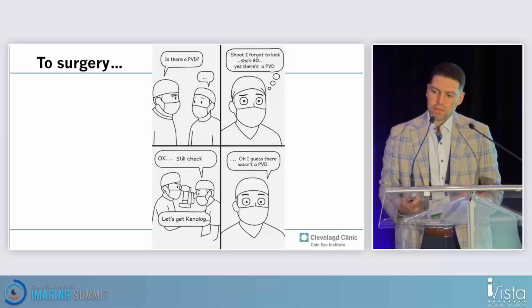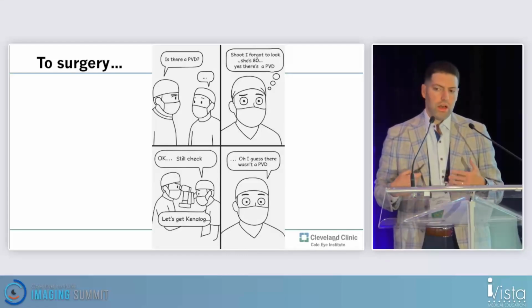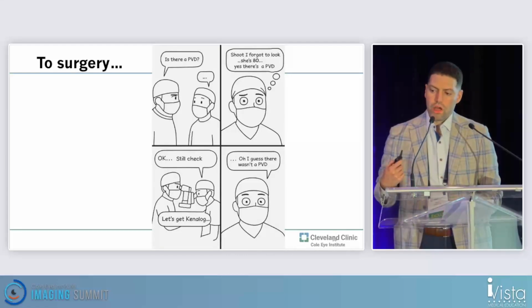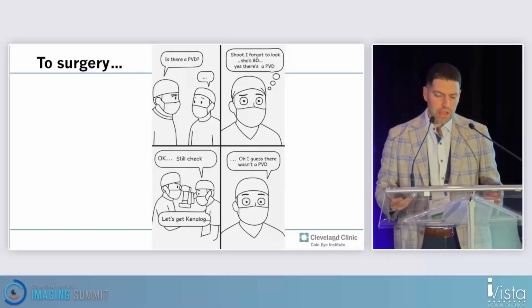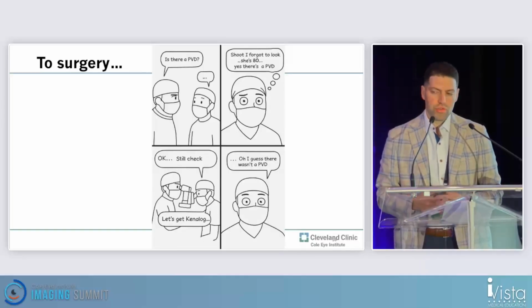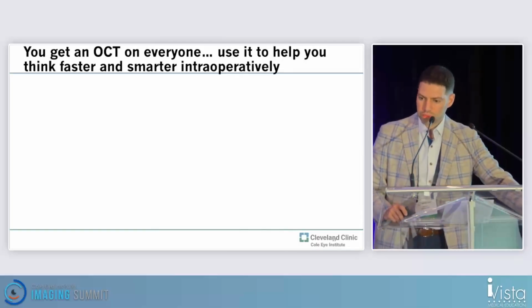So in these cases, I really find that pre-op OCT is very important at increasing your pre-test probability for if the hyaloid is attached. There's many times where you'll just kind of go down with the cutter, you think the hyaloid is up, and you're really doing a semi-good job at assessing for the hyaloid. If you really know it's down, it increases your surgical efficiency, and it can prevent you from having some mistakes in cases where you're pretty sure the hyaloid's up, but imaging is clearly showing you that it's not.